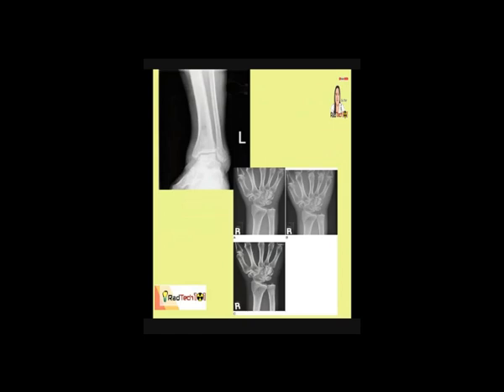So, we have here, ito yung mga auxiliary. So, this is, for example, the left foot of the patient. Ito naman, right hand ng patient. Right. So, again, ilalagay natin siya sa area na malayo sa area of interest. Hindi tayo naglalagay dito. Hindi tayo naglalagay dito. So, nasa gilid lang na basta within the area of the collimated area. So, ito. Kasi dito tayo naglagay sa labas.